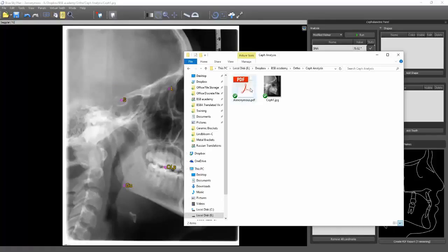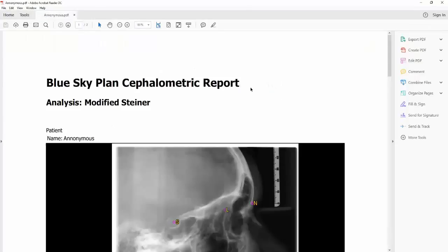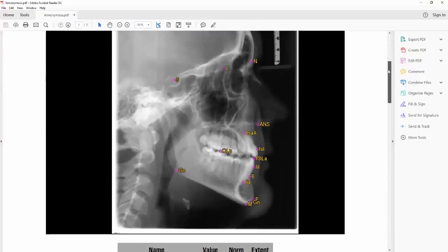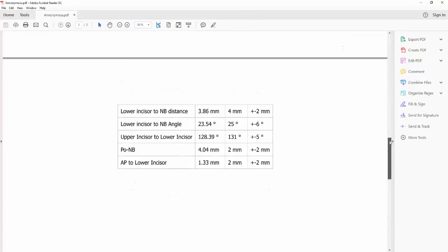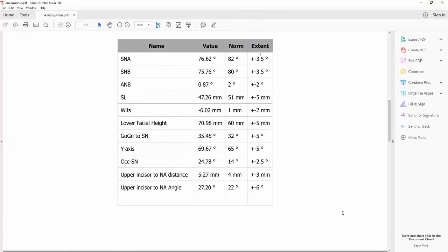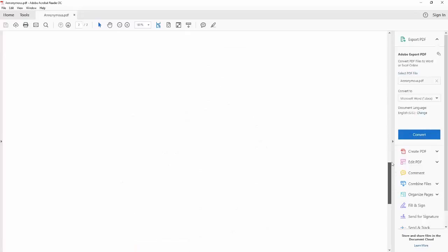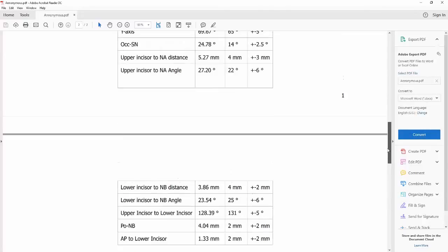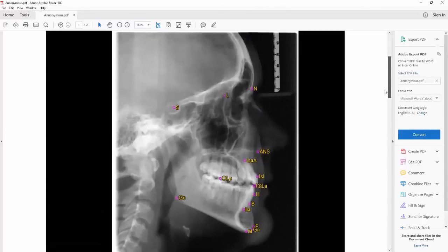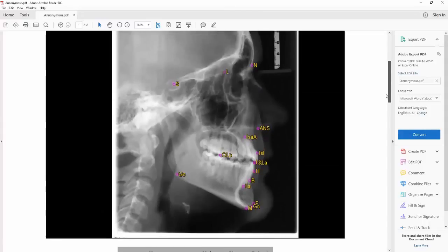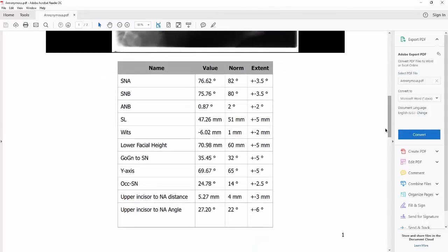Here is the PDF that's created. Let's open this up. We can scroll down here and see all of the various numbers with the norms and the standard deviations. Pretty straightforward. Each analysis is going to be a little different, of course. But here's your PDF — you can attach it to your patient chart or whatever you want to do and proceed with your treatment planning.